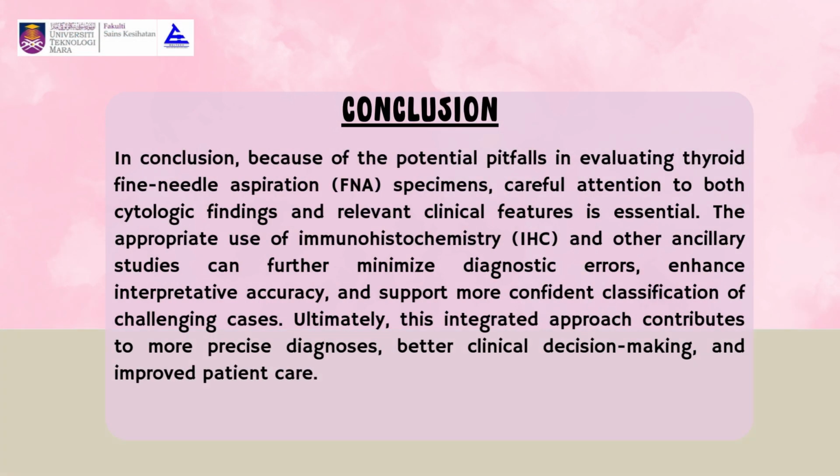Lastly, conclusion. So, in conclusion, because of the potential pitfalls in evaluating thyroid fine needle aspiration specimens, careful attention to both cytologic findings and relevant clinical features is essential. The appropriate use of immunohistochemistry, IHC, and other ancillary studies can further minimize diagnostic errors, enhance interpretive accuracy, and support more confident classification of challenging cases. Ultimately, this integrated approach contributes to more precise diagnosis, better clinical decision making, and improved patient care.